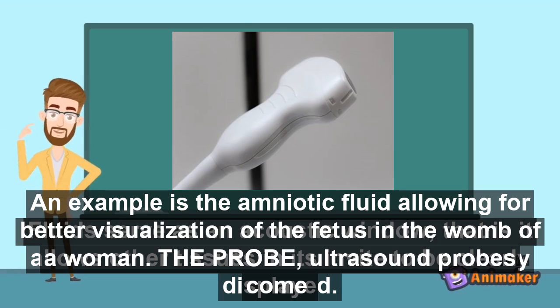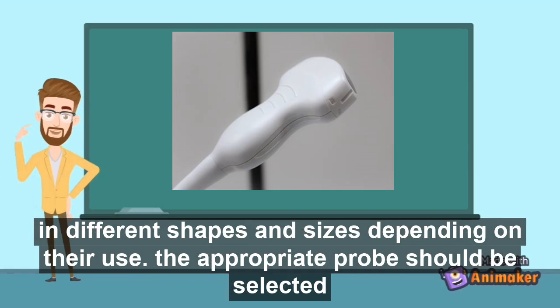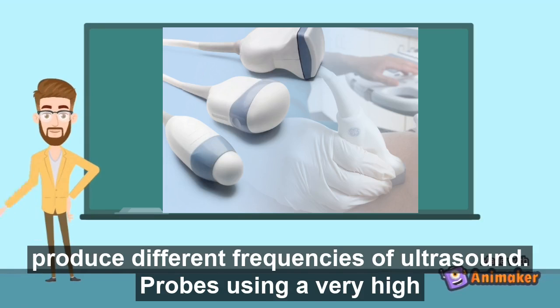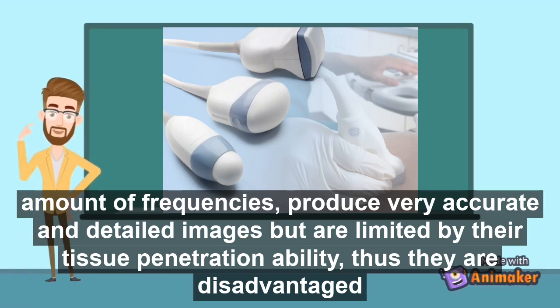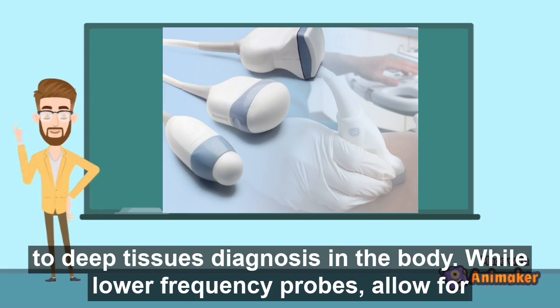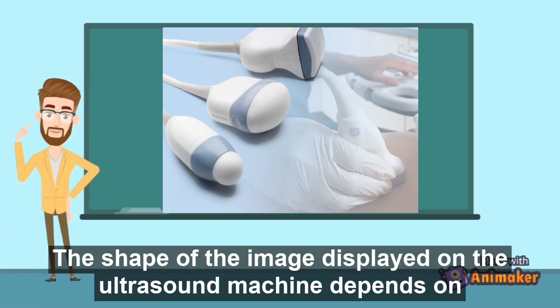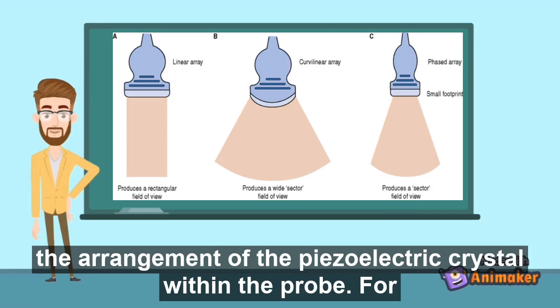The probe. Ultrasound probes come in different shapes and sizes depending on their use. The appropriate probe should be selected to explore specific areas of diagnostic interest. Different probes also produce different frequencies of ultrasound. Probes using very high frequencies produce very accurate and detailed images but are limited by their tissue penetration ability, thus they are disadvantaged for deep tissue diagnosis. Lower frequency probes allow for deeper penetration at the cost of lower image resolution. The shape of the image displayed depends on the arrangement of the piezoelectric crystals within the probe.